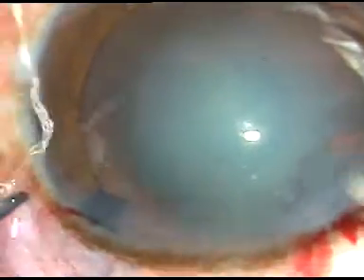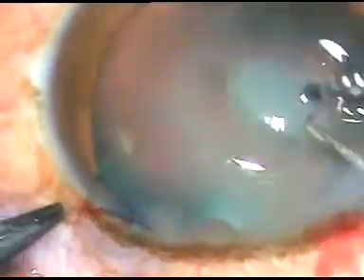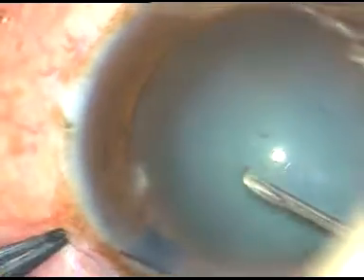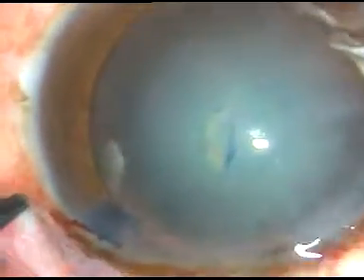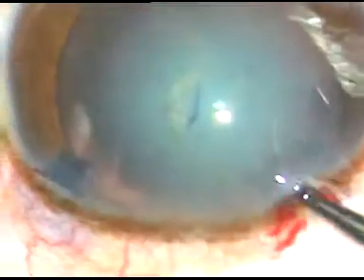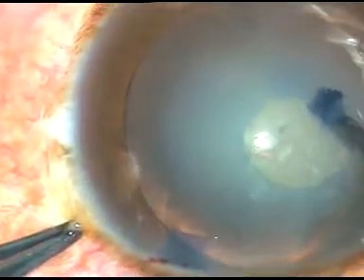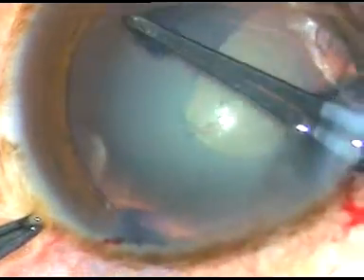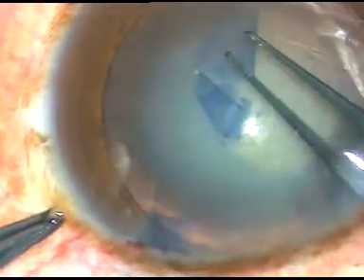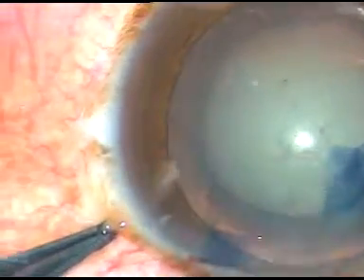Now I am going to incise the anterior capsule of the cataractous lens with this cystotome — it is a 26 gauge bent needle. I hold this capsular tag with the utrata forceps. I go anticlockwise and I make this rhexis. It is an almost circular rhexis.